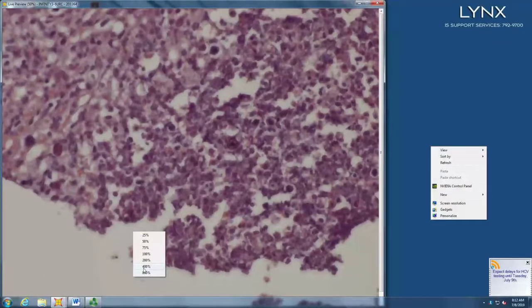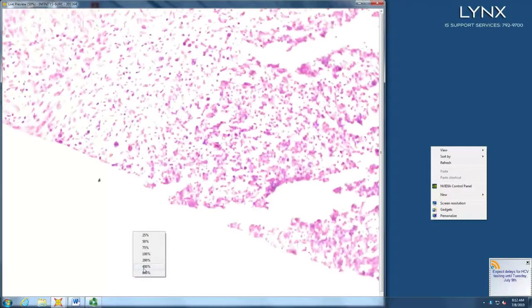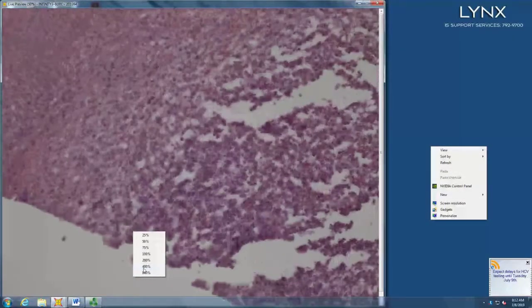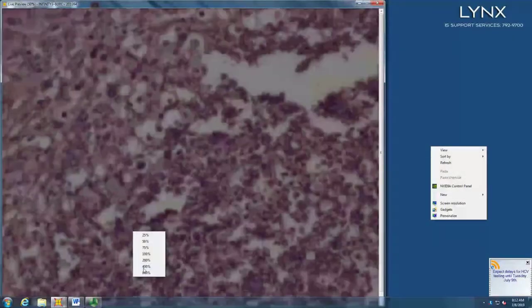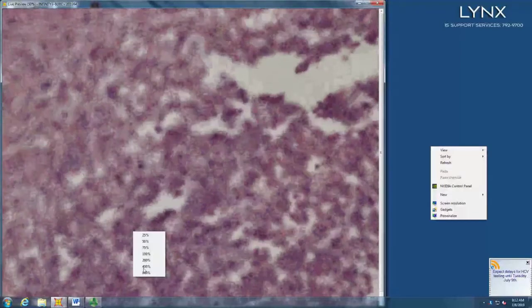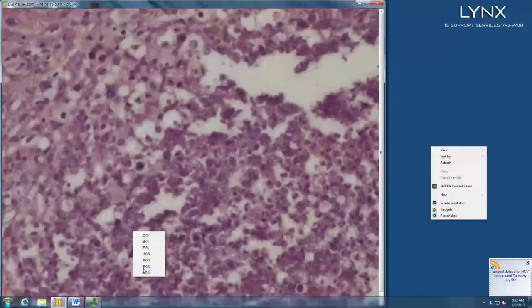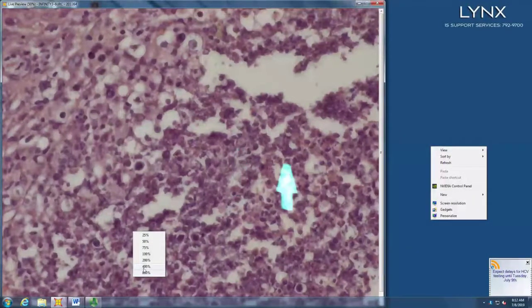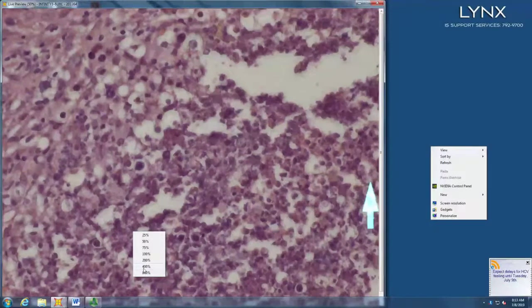So sitting within an abscess, you have those structures, and probably the most diagnostic is this one right there. Or that one right there. It's sort of like fungus, I don't know.